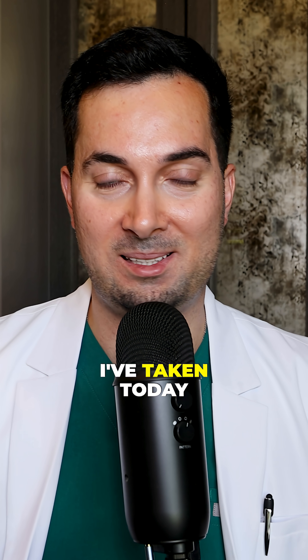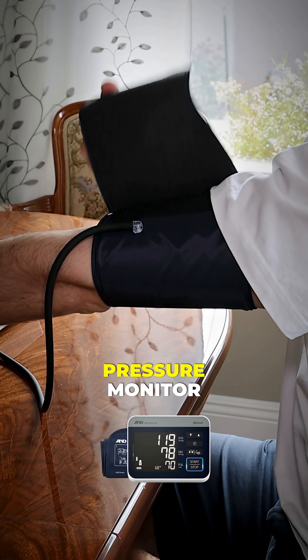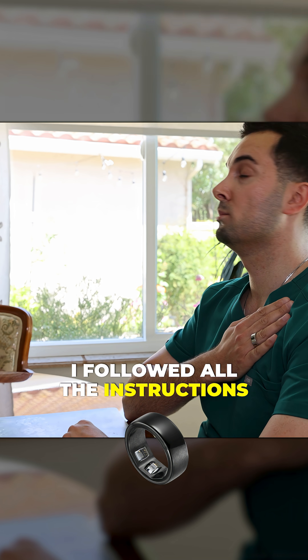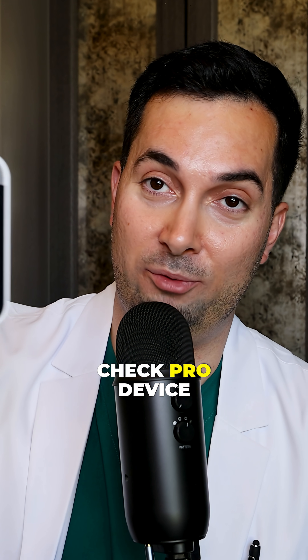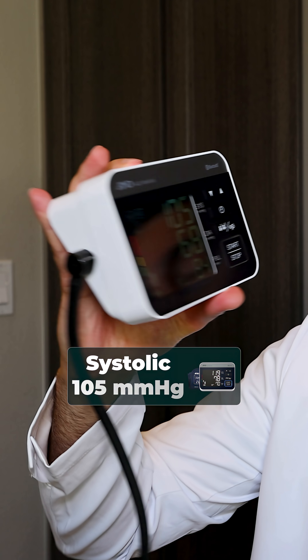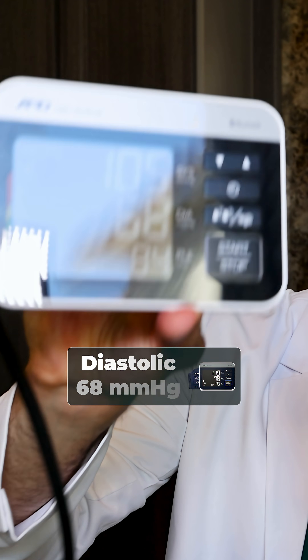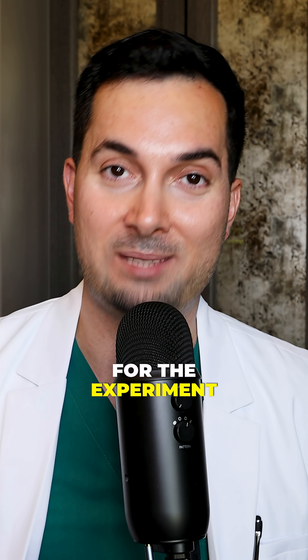For all the readings I've taken today I've followed all the correct procedures, whether it's the A&D Medical Blood Pressure Monitor, the smartwatch, or the smart ring — I've followed all the instructions to do it correctly. Here is my blood pressure reading using the A&D Medical Precision Check Pro: a systolic of 105 and a diastolic of 68. From now on that's going to be our baseline for the experiment.